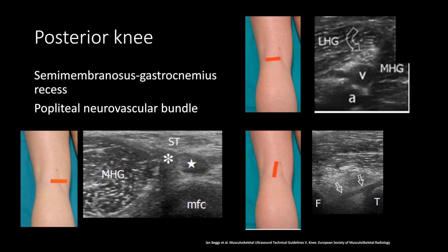Have the patient prone with the knee extended for evaluation of the posterior knee. Check the semimembranosus and the gastrocnemius recess between the medial head of the gastroc, where the tendon is denoted by the asterisk, and the semimembranosus tendon is denoted by the star. At the popliteal fossa, you can examine the popliteal artery, the vein, and the tibial nerve. The artery is A, the vein is V, and the curved arrow is the tibial nerve. At the bottom right, you can sometimes see part of the posterior cruciate ligament.